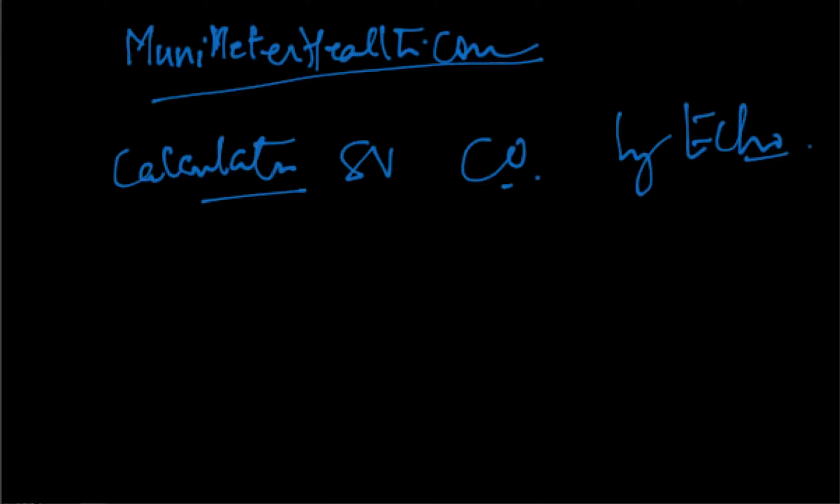So, assuming that we are looking only at the left ventricle, just mind you. Here's your left ventricle, and if you will, your aorta, I'll show the aorta something like this. And obviously, this is your left atrium. The left atrium is pouring blood from here. And this is, just remember, a schematic. Then as it goes up here, it goes via the cross-sectional diameter of the aorta, and the entire aorta is getting filled per beat as stroke volume, if you will.